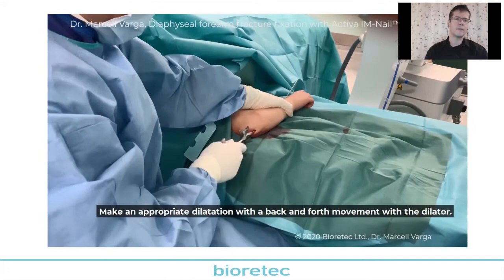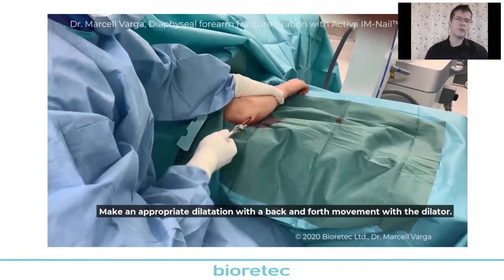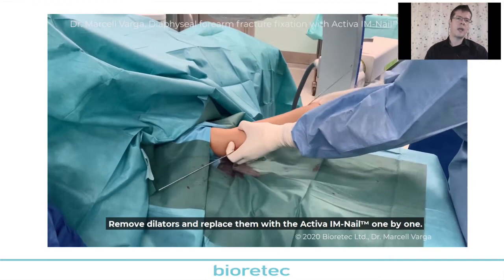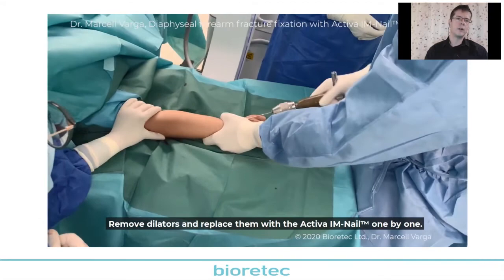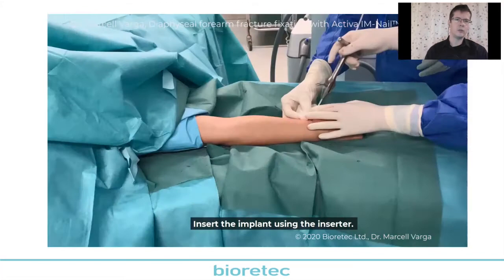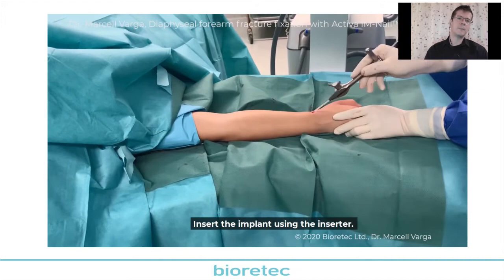I have to make enough space, and I have to choose the thickest implant I have. Here we can see, as the dilatators are in place, I check my reduction, and now the most difficult part of the operation comes, because I have to remove the dilatators, and I have to maintain my reduction. This is the point when I take my bioabsorbable nail into the inserter, and I try to find my hole, and I slip the bioabsorbable IM nail into the medullary canal.